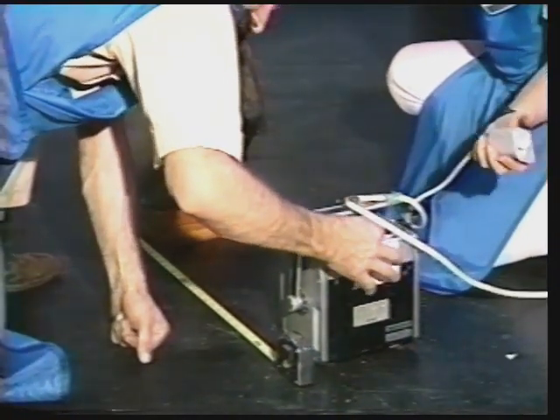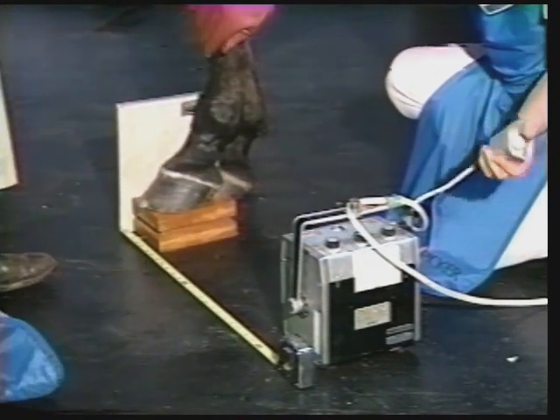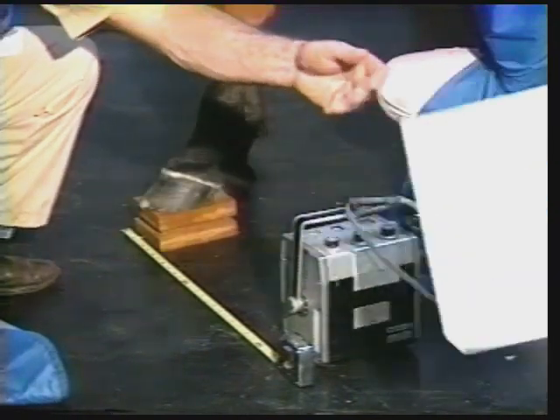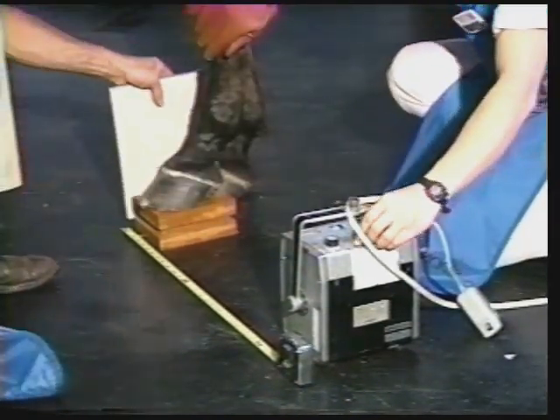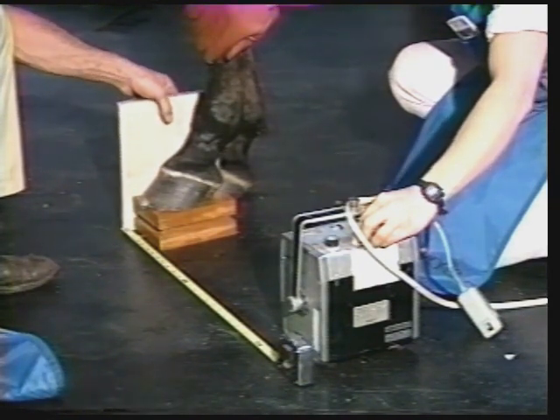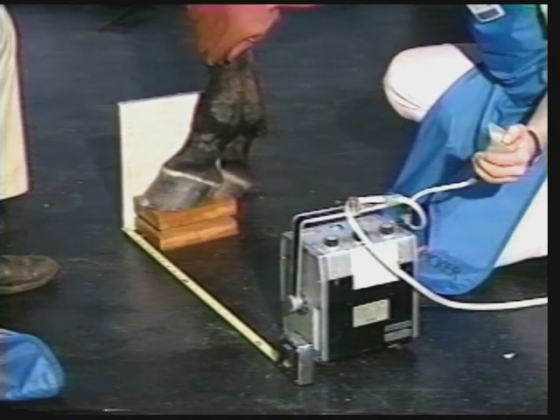Using this device, I will take all the standard views except the lateral and the straight-on AP. I will now use the wooden block, which is 3 inches deep, 5 inches wide, 7 inches long, with a wire embedded in the top, to take my standard lateral. This will put the primary beam of my machine, which is about 4 to 4.5 inches from the ground surface, just at the very bottom of the coffin bone. This way I get a true lateral each and every time.